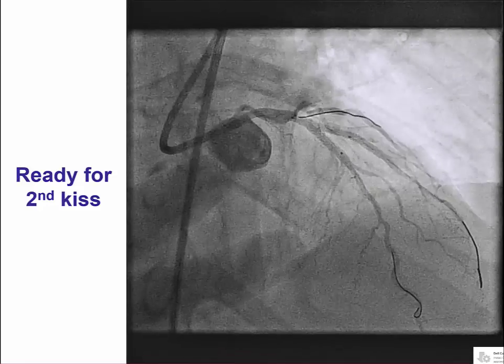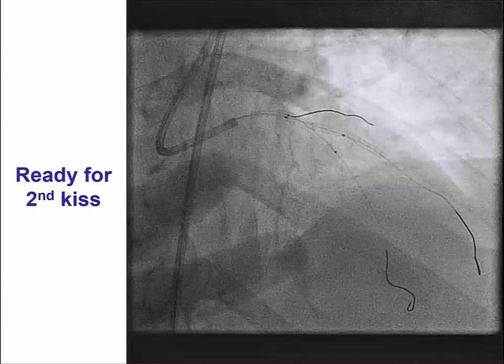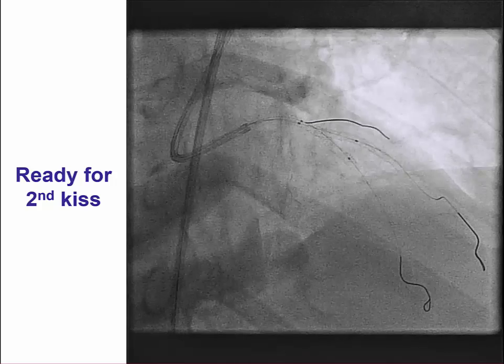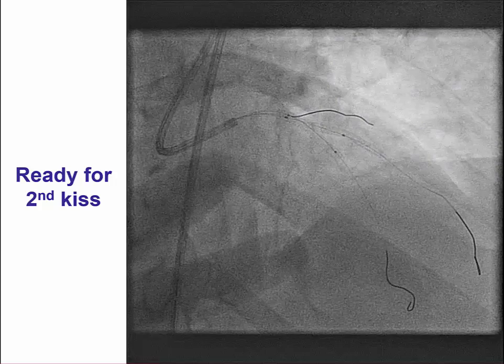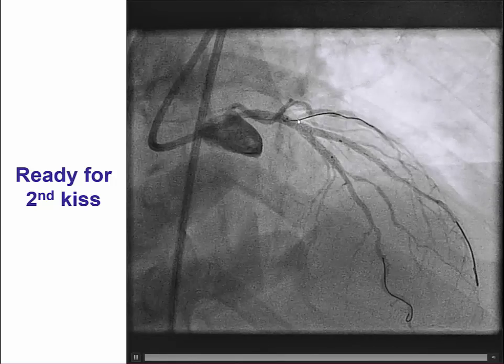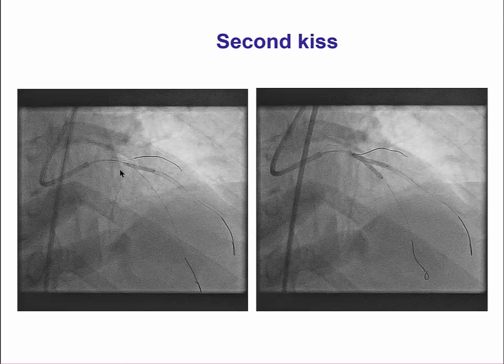Now we have two wires in place and are ready to perform the second KISS procedure. One of the limitations of the DK CRUSH is that it requires rewiring the side branch twice: first after deployment of the side branch stent, and second after deployment of the main vessel stent. We also had a more proximal diagonal branch with some ostial disease, so we advanced a wire there to protect it. The second KISS was performed as a two-step procedure — first inflating at high pressure into the diagonal branch (20 atmospheres), then performing simultaneous KISS balloon inflation at 12 atmospheres into both the side branch and the main vessel.